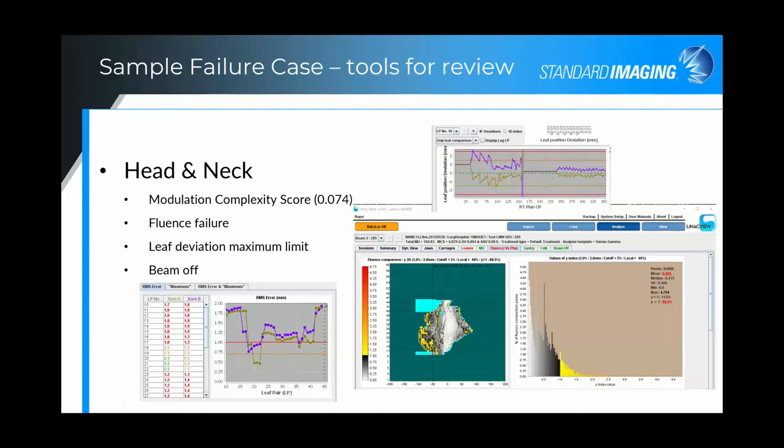in the delivery. I wanted to bring up quickly, because I don't think I mentioned it earlier, that not in the most recent release, but the one before, release 3.12, we did introduce a feature into LinacView where if you keep your LinacView computer in dosimetry, as soon as the planning is done, there doesn't have to be an auto export, but the dosimetrist can manually import into LinacView to check the modulation complexity score.